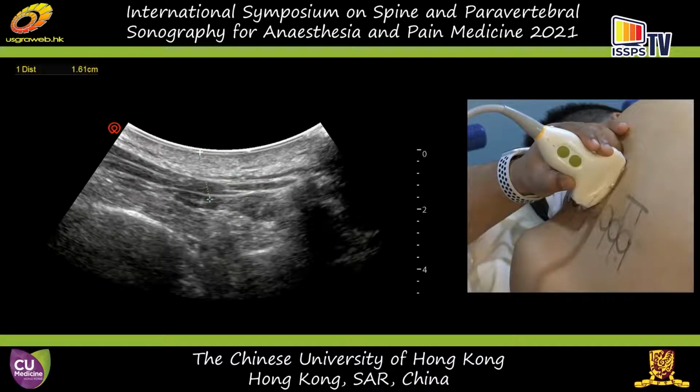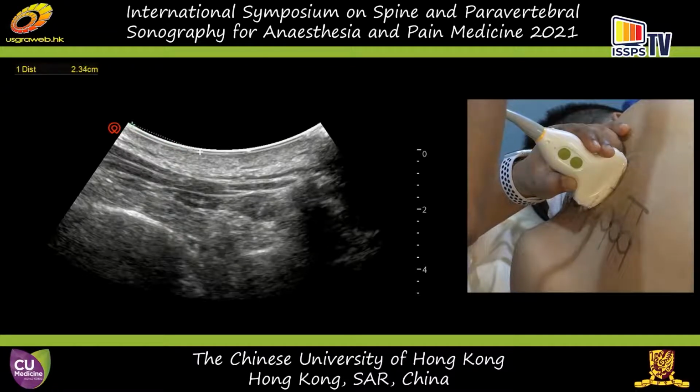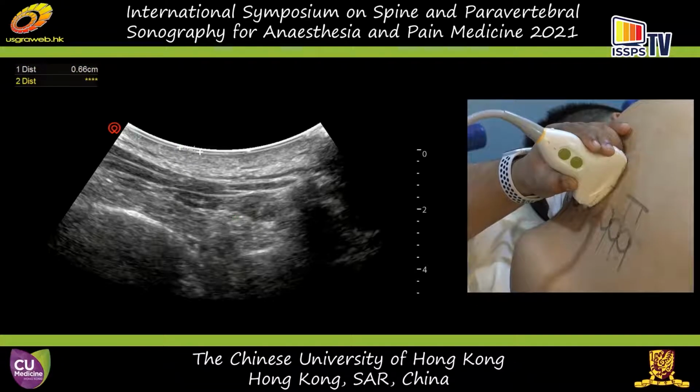Put it near the orientation marker first. No, put it where the needle enters. More laterally near the orientation marker. Yes, more towards the skin. Yeah, so the needle would enter somewhere there, and then move the trackball. Okay, we have some technical issues here. Move it to the edge of the film.